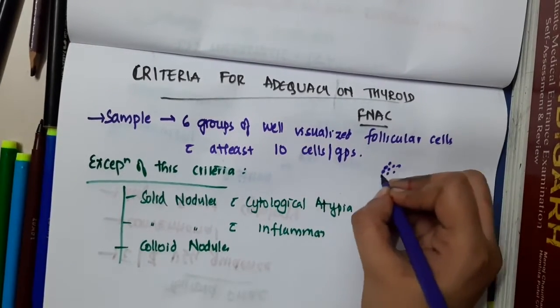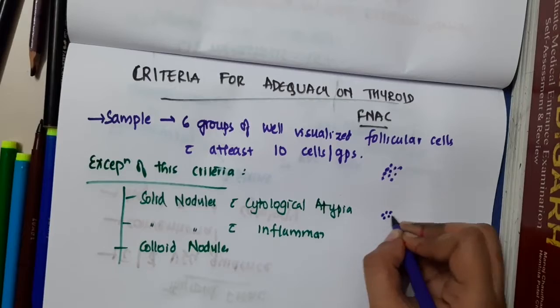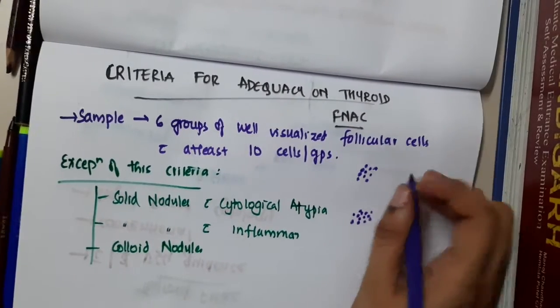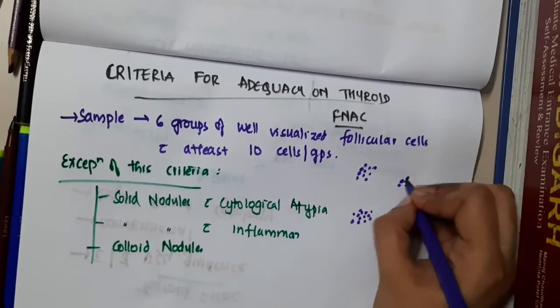So how do you see this? This is one group with more than 10 cells, this is another group with more than 10 cells. So this is how you see it in microscopy.